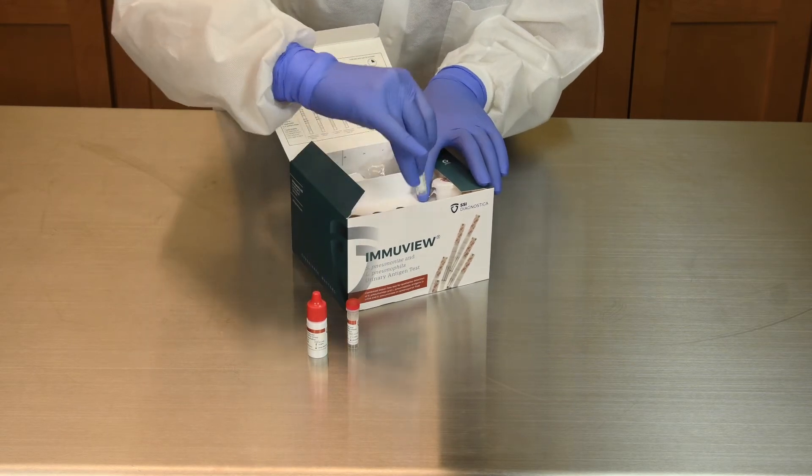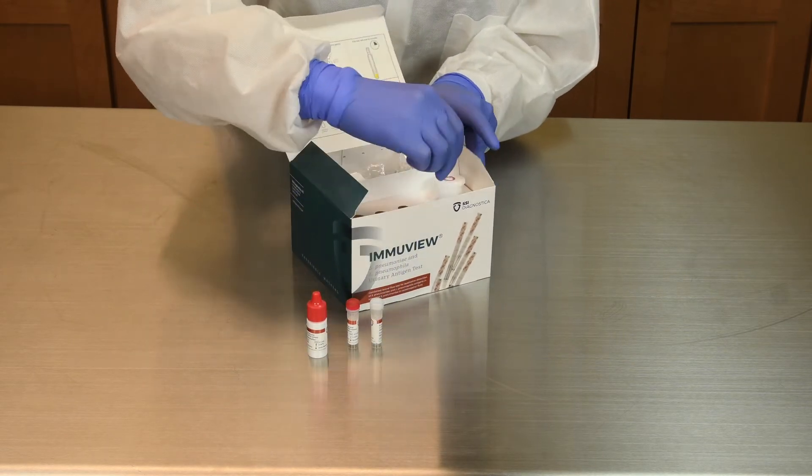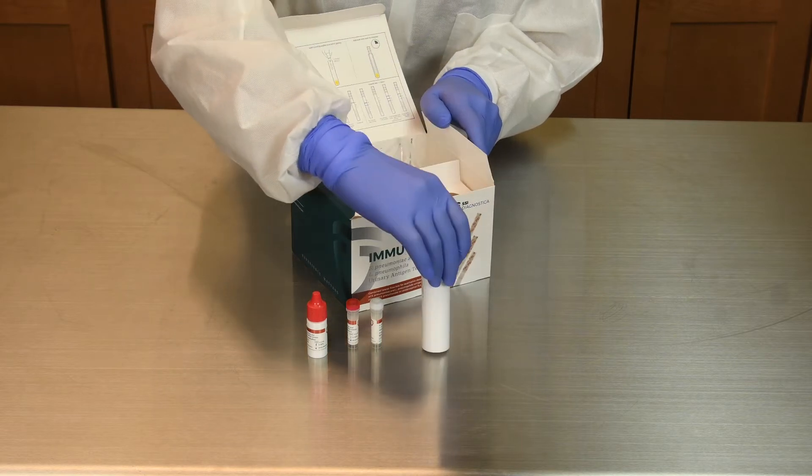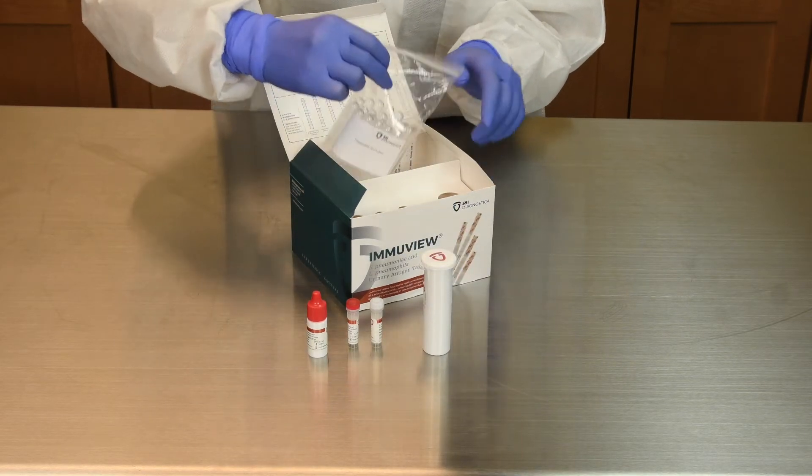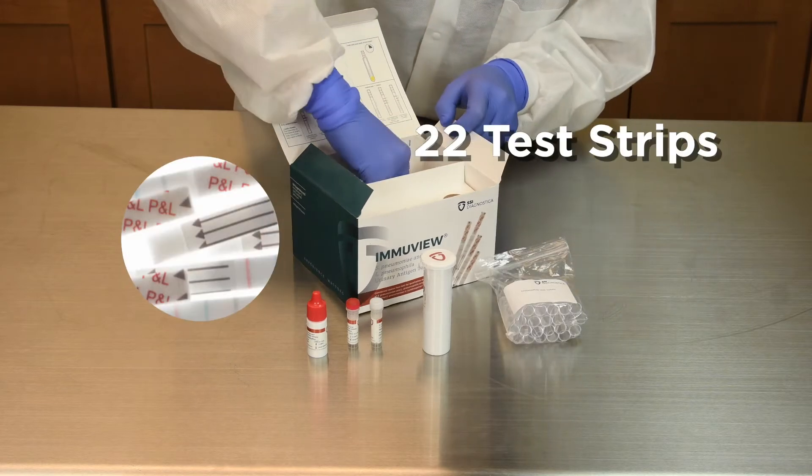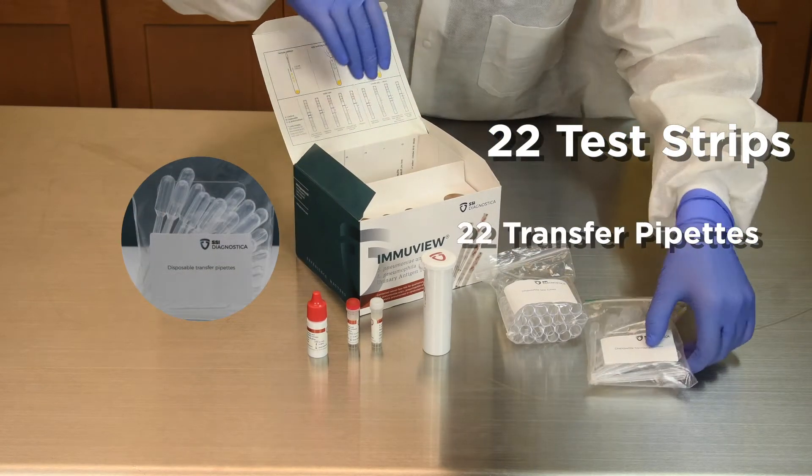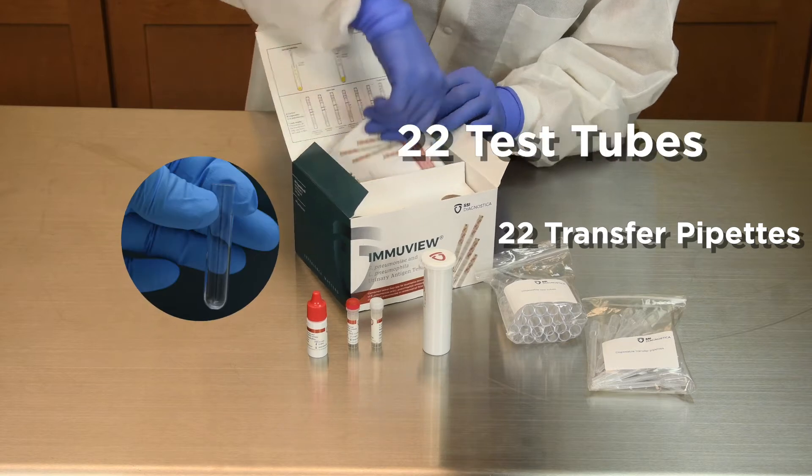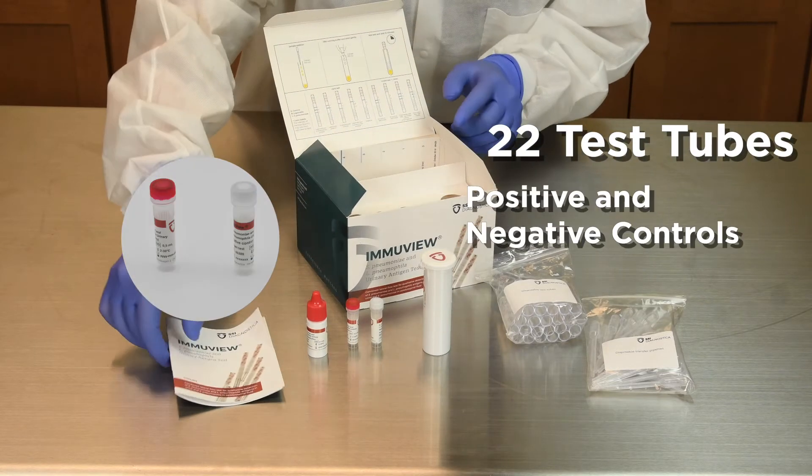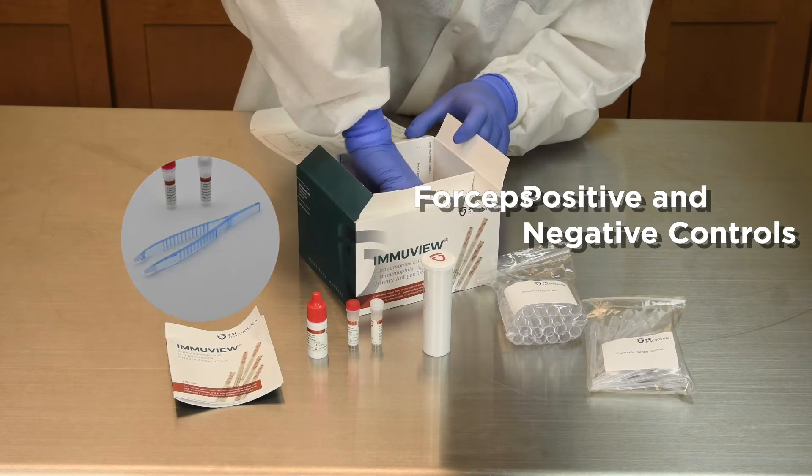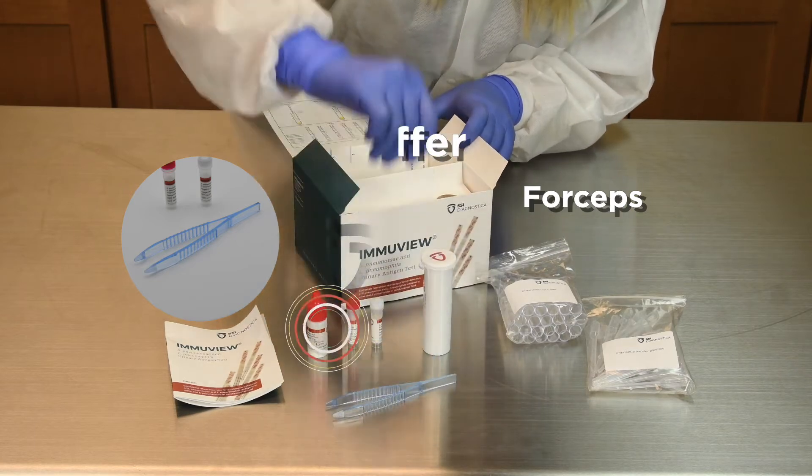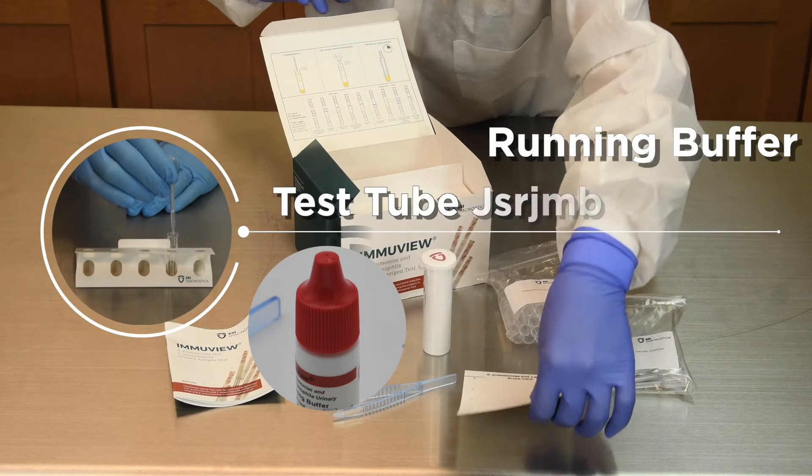Both tests can be performed from a urine sample since bacterial antigens are shed through the urinary tract. The ImmuView kit contains 22 test strips, 22 transfer pipettes, 22 test tubes, positive and negative controls, forceps, running buffer, and a test tube holder.